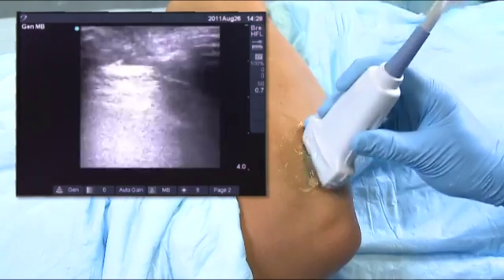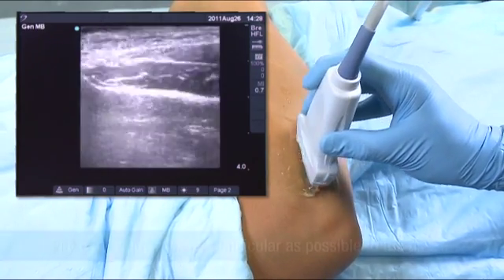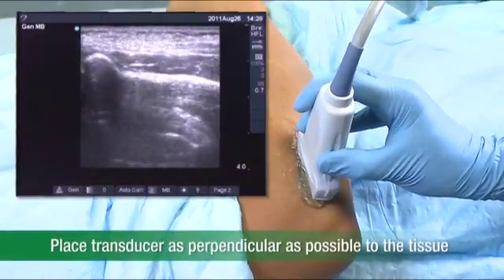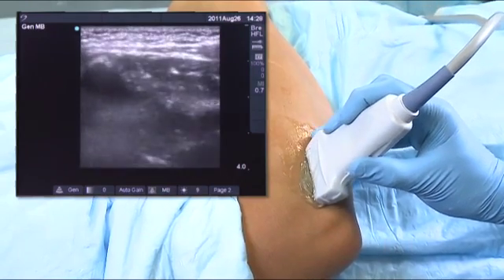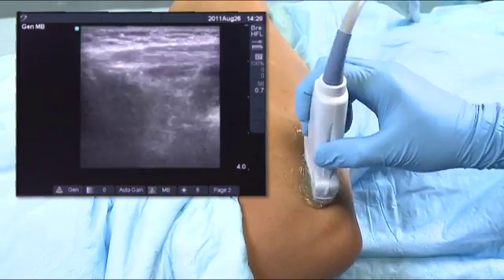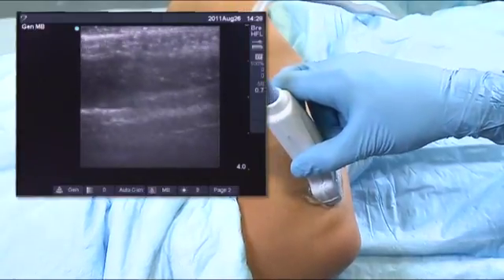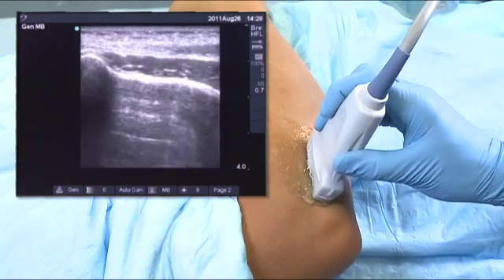Another trick to evaluate transducer positioning is to make the transducer as perpendicular as possible to the tissue. If you were to bevel the transducer in a forward-leaning fashion or in a backward-leaning fashion, you lose any appropriate images that you would otherwise have of the epicondyle.